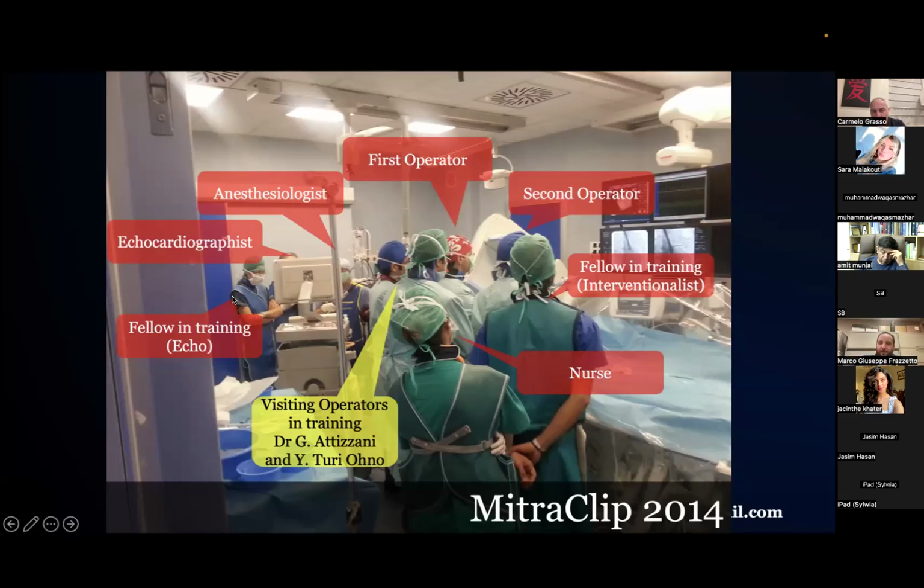The echocardiographer, I used to put on my left side. As you can see, he can see the angio screen. This is important both for communication, because we are really near, and because the echocardiographer can see the angio screen and understand where we are and what we are doing.